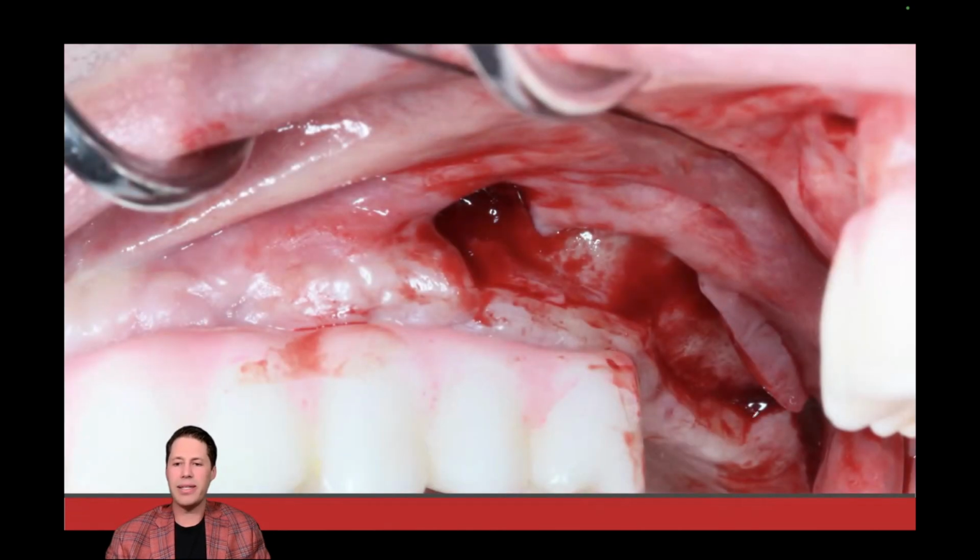So as you can see, my incision design, just like we had talked about, a distal vertical, more of a mid-crestal, cheating to the buccal a little bit, wrapping around and dropping our vertical off of the mesial aspect here. So we know, based off of our CBCT, roughly where that window should start. It's going to be right in this area. We can go back as far distally as we want.